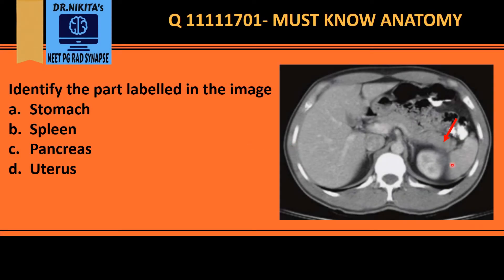In this question we have to identify the labeled part. First of all, this is a CT abdomen because the bones — the vertebra and the ribs — are white. This is a contrast-enhanced CT scan because the vessel, the aorta, is white, and the kidneys are also white.